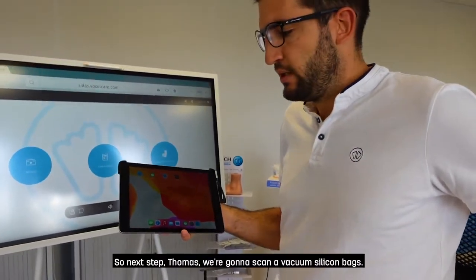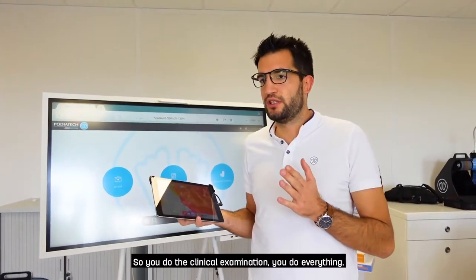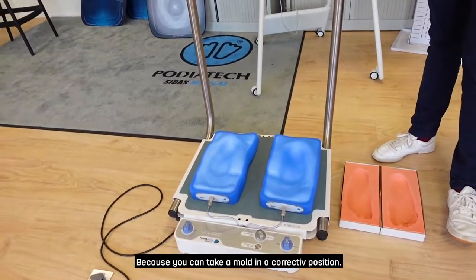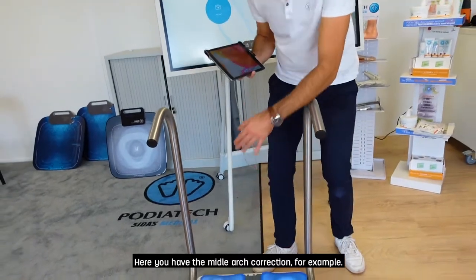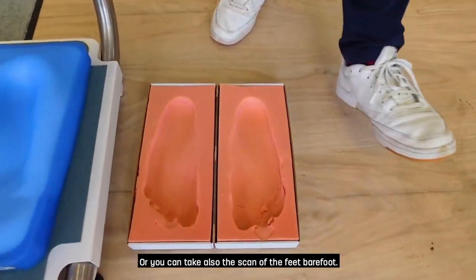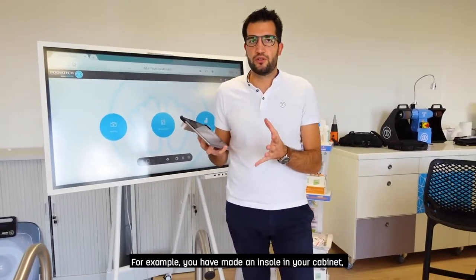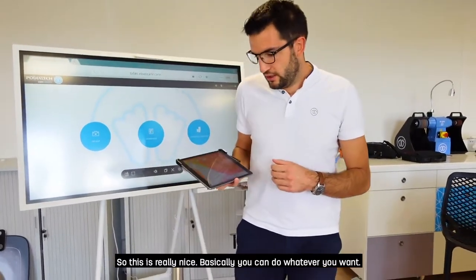Next step, we're going to scan a vacuum silicone bag. The process with your patient is basically the same — you do the clinical examination, you do everything, and then instead of making your insole by yourself, you take the mold. You have multiple options: first you take the mold with the vacuum bags — we advise this option because you can take a mold in a corrective position. You can also use a foam box or scan the feet barefoot. You can even scan existing insoles from last year if the patient wants a second pair.